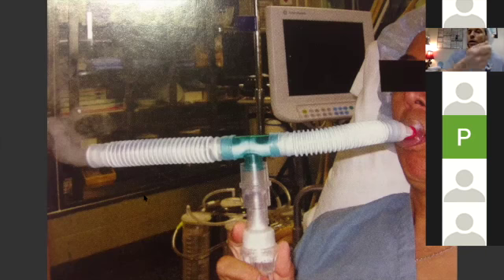So you grab a nebulizer like you'd give albuterol. Now this one is showing breathing through the mouth. Sometimes it's better to put a simple mask on, so you also get the nose a little bit as well as the mouth and the larynx. And you put it to 6 to 8, and you put 4 cc's of 4% lidocaine without epinephrine in the chamber. And then you instruct the patient, take some nice deep breaths, and you watch them and make sure that they're topicalizing well.